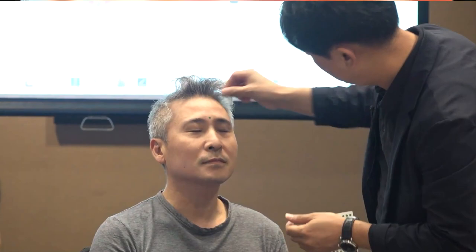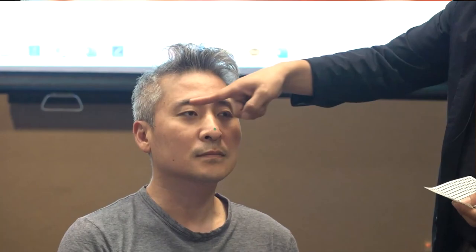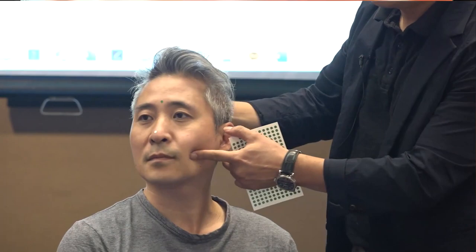Although this patient has all teeth, let's imagine this patient doesn't have any teeth, or only anterior teeth remain. So first of all, you have to mark the middle line of the face. And then there is the interpalpebral line and the midline. And next we have to mark the camper's line.